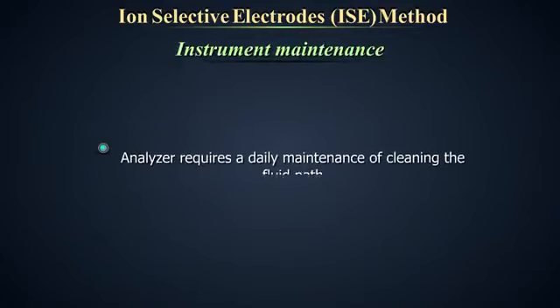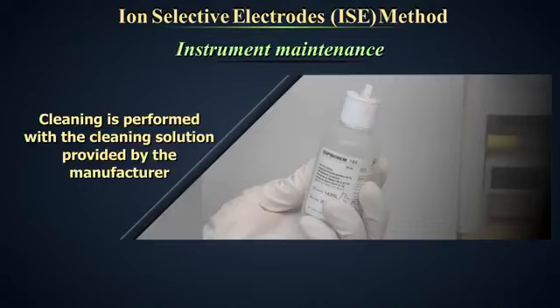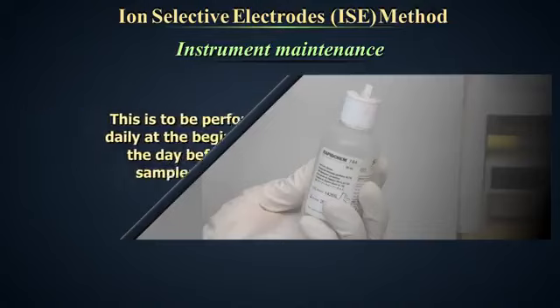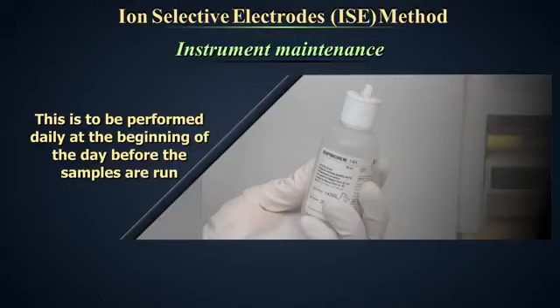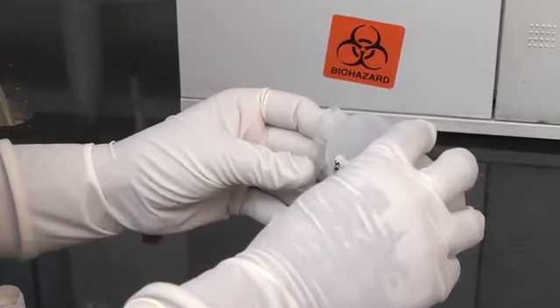Instrument maintenance. The analyzer requires a daily maintenance of cleaning the fluid path to remove protein deposits. Cleaning is performed with the cleaning solution provided by the manufacturer. This is to be performed daily at the beginning of the day before the samples are run. Take the cleaning solution in a clean container to avoid contamination of the remaining solution.